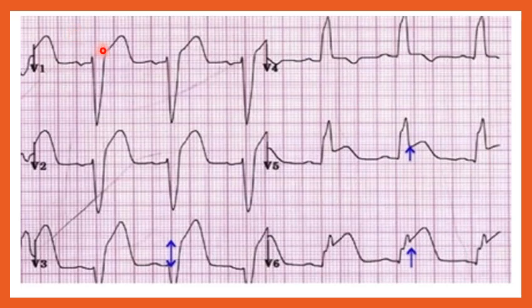Okay, so it looks like we don't have that nice, beautiful rhythm strip to work with, but it certainly looks like this patient's mechanism that's running the heart is the sinus mechanism, right? So we have sinus rhythm. And then if you take a look at these QRS complexes, the QRS complexes are wide, yes? So you take a look and, gee, the QRS complex is easily 0.18, give or take. So we know we're looking at sinus rhythm with some sort of bundle branch block. So we look at our right and left chest leads.